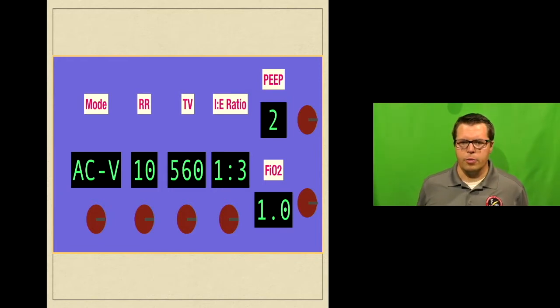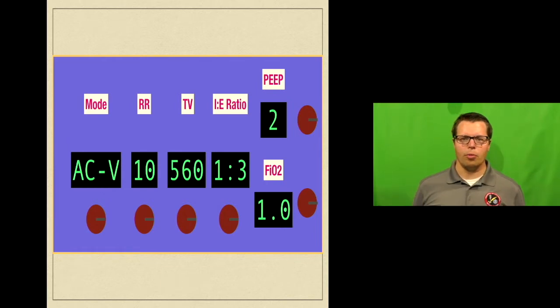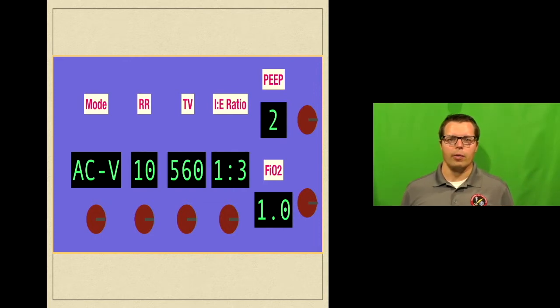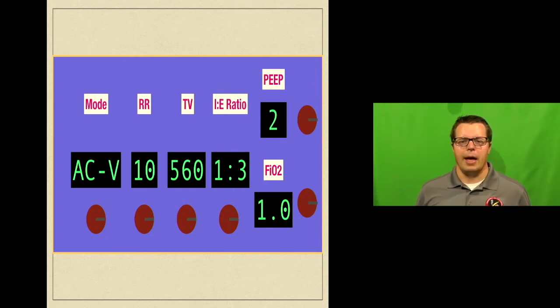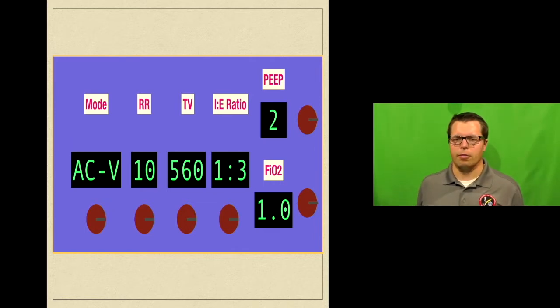So in terms of oxygenation, we do want these guys to get a lot of oxygen, again, to start off with, so go ahead and turn the FiO2 up relatively high to give them a cushion. The other thing you might wonder about is, well, what about PEEP? You just said their whole problem is that they can't breathe out very well. So shouldn't we put PEEP at like 0, because we don't want to cause any more obstruction. We don't want to cause any more difficulty breathing air out. So why wouldn't you set PEEP to 0? I'm going to still say you need to set PEEP at least 2, if not 5, and I'm going to go with 5 generally speaking.